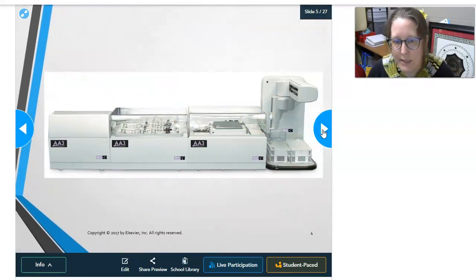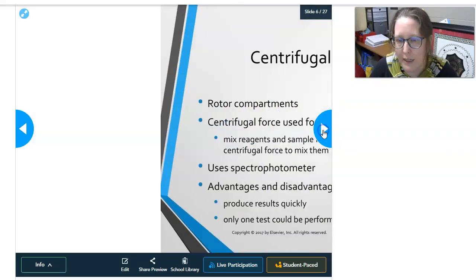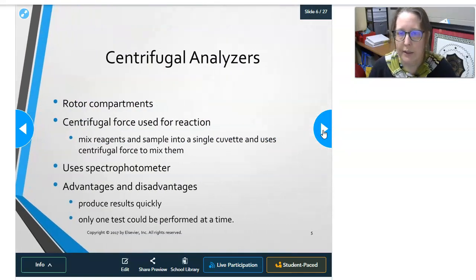And then this is an example of a continuous flow analyzer. I know it's kind of hard to see, but you'd be loading, it'd be sampling stuff here, and then you can see the system of tubing and peristaltic pumps and all of that. It's just one example. Again, not used widely in a clinical lab.